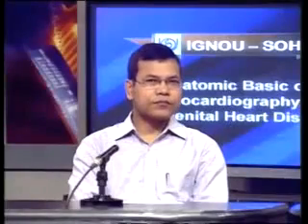So you cannot go by the body axis, because the heart position changes. In the fetal or neonatal period it is almost horizontal, then it rotates and comes almost to the long axis in the adult patient. So your probe position should be according to the cardiac axis, not according to the body. You have to change the position of the probe according to the images.